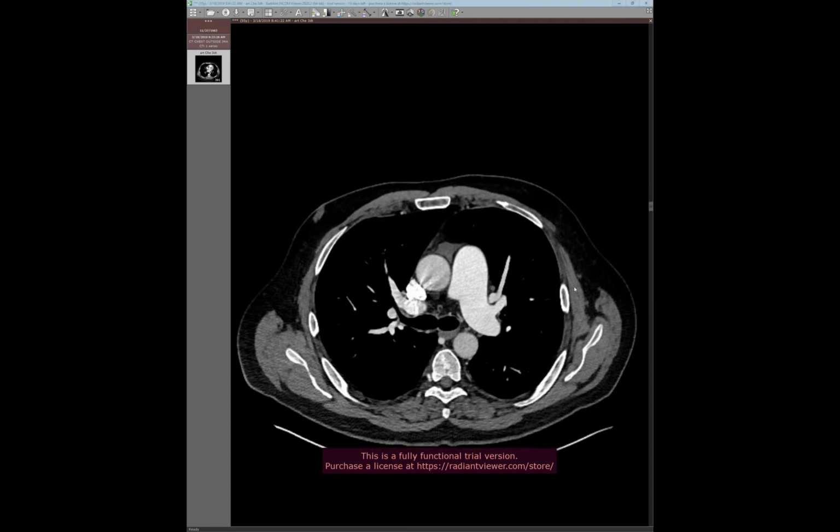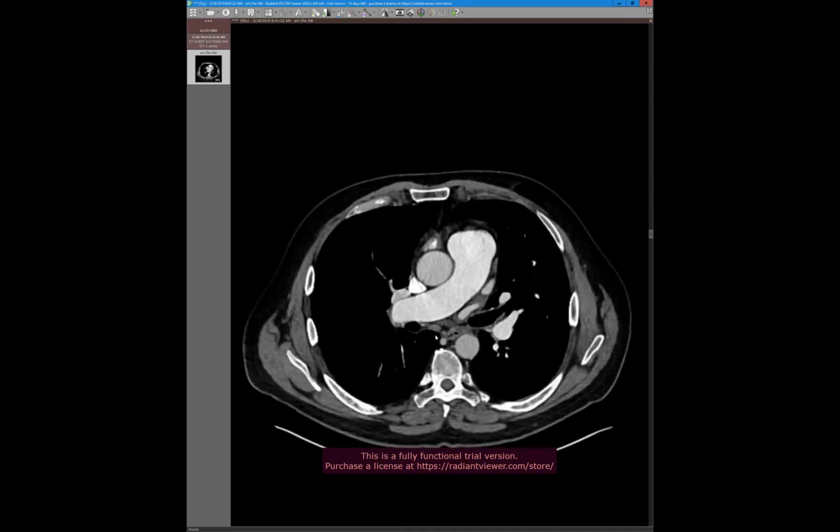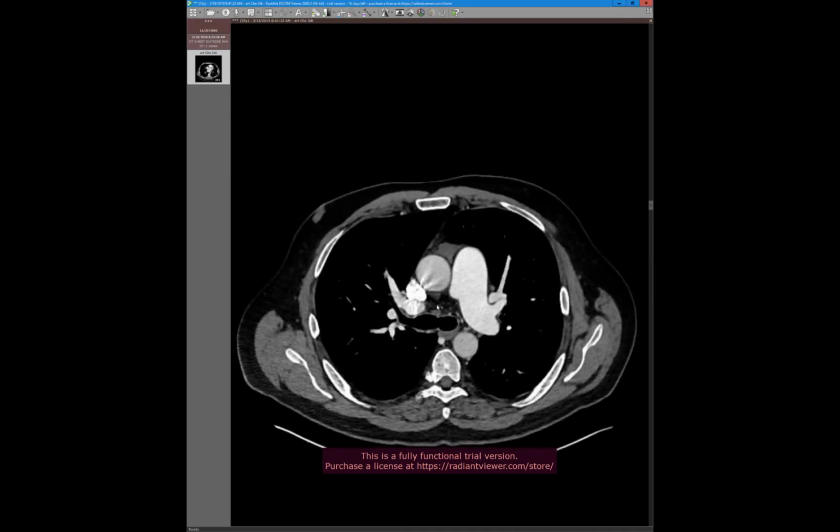And I found a couple of case reports back then, and there was one of a patient having a TIA, like you were saying, because of change in pressure, I think if you Valsalva. But if you look up persistent levoatrial cardinal vein. Doing that right now. Yeah, that's a really pretty example. Okay. Levoatrial cardinal vein, yeah.